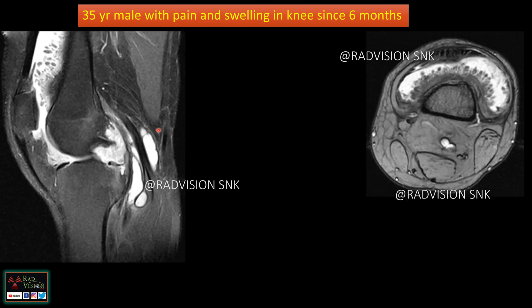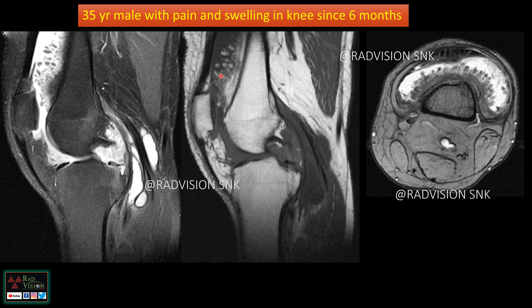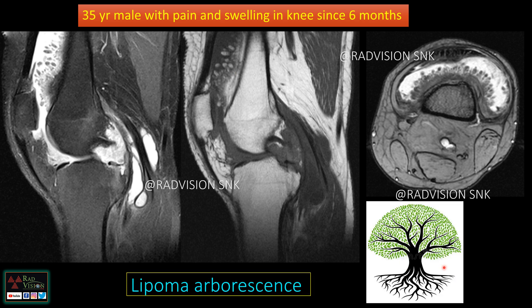Next case: a 35-year-old male with pain and swelling in the knee for six months. You can see multiple frond-like projections noted within the synovium with thickening of the synovium. There is free fluid noted within the joint space even extending into the suprapatellar recess, and a small baker's cyst. These frond-like synovial projections show minimal blooming on GRE, and on T1-weighted images they have signal intensity similar to fat. These fat-like projections of the synovium resemble the branching of a tree — this is a classic case of lipoma arborescens.